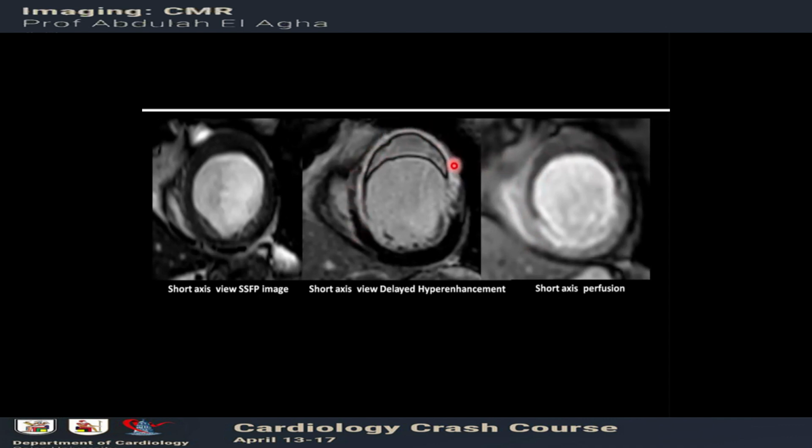What we see here, the whitish thing is the scar. That's why it's a transmural scar. And what we see as a preserved myocardial thickness was a thrombus. So we were deceived by echocardiography and even deceived by CMR CINE. So here, tissue characterization will tell you that this is a thrombus. And this is very important. You need to give the patient what? Anticoagulation, right?